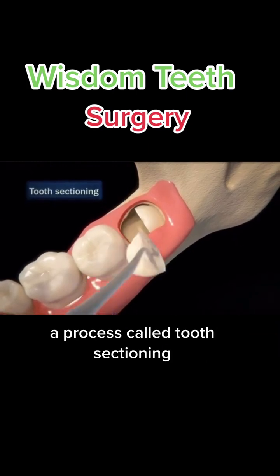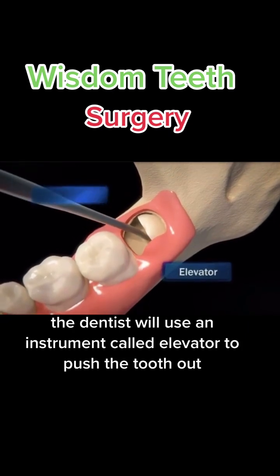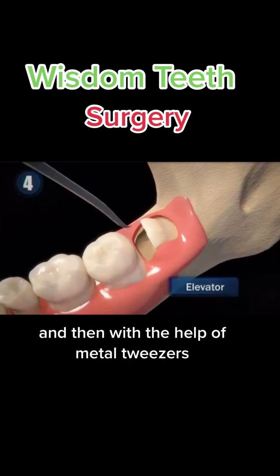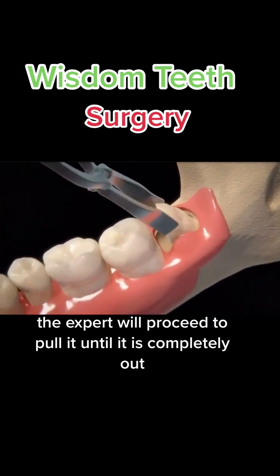a process called tooth sectioning. Once the tooth is divided, the dentist will use an instrument called an elevator to push the tooth out. And then with the help of metal tweezers, the expert will proceed to pull it until it is completely out.